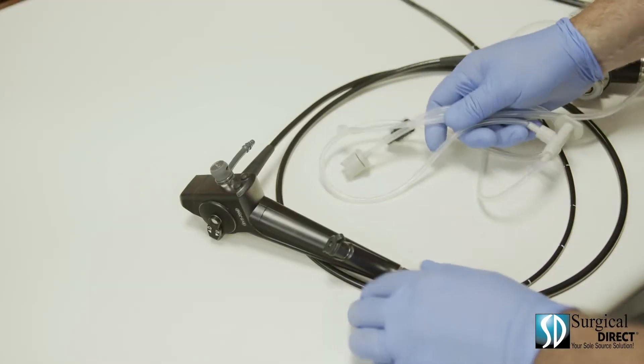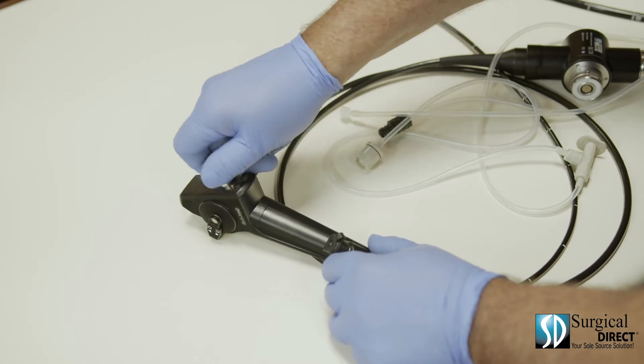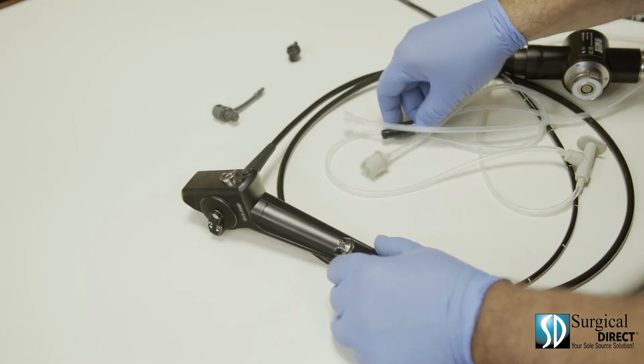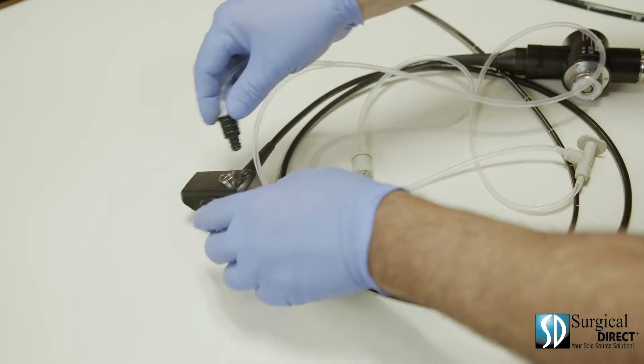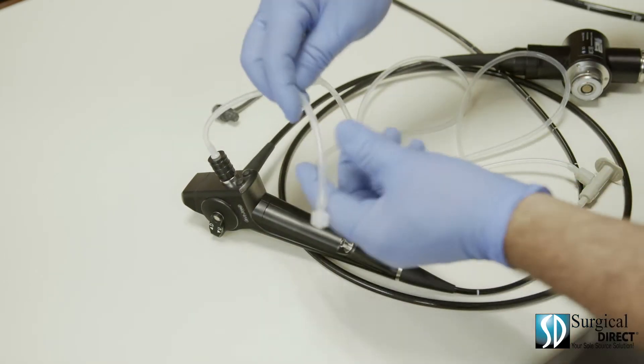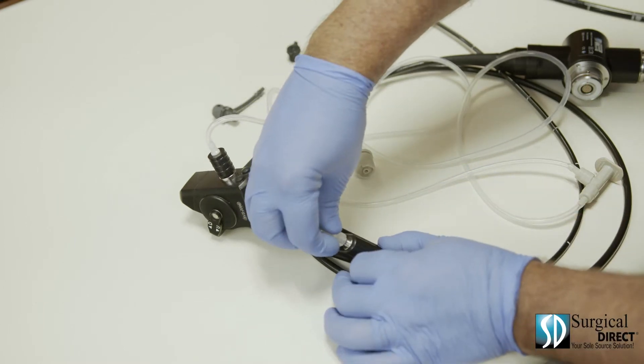The cleaning adapter for the bronchoscope is a little different. Remove the suction valve and remove the biopsy port cap. Insert the black end into the suction hole, then attach the lure lock to the biopsy channel.